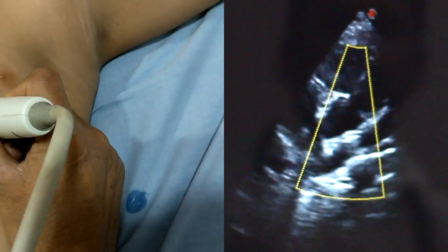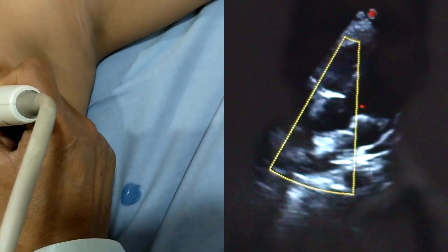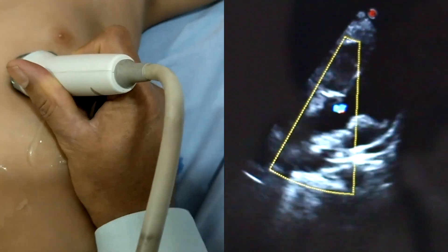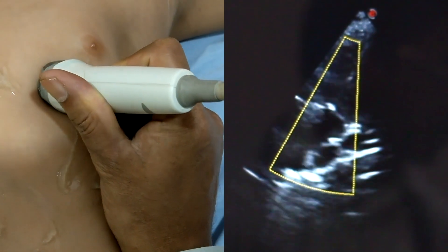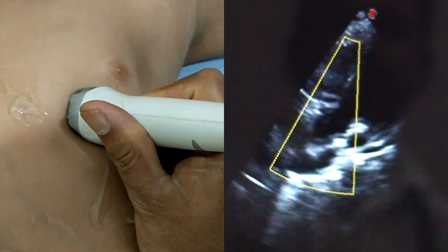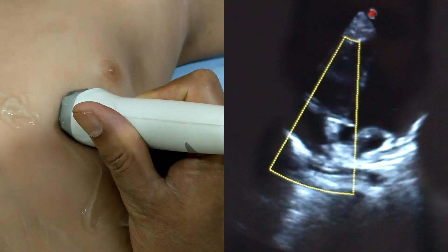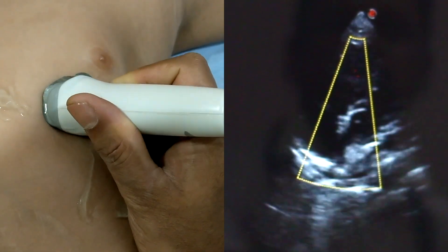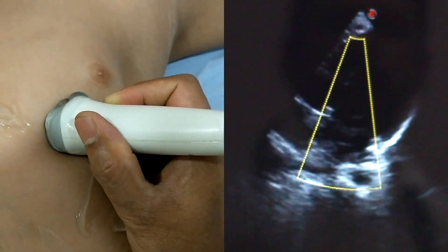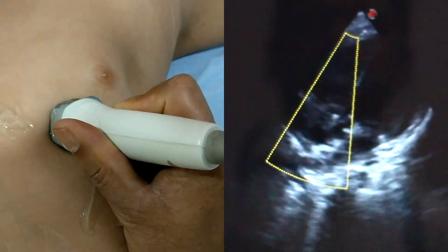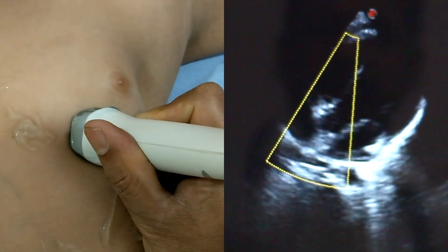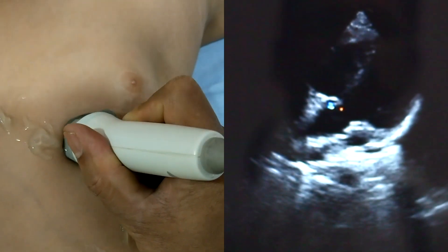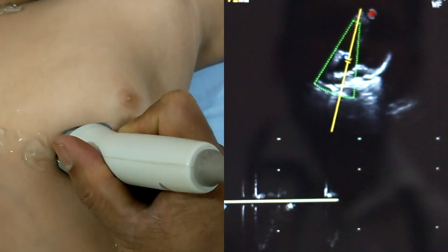This view is the apical five chambers view. Here we can clearly see the aortic valve and ventricular septum. Perimembranous VSD or muscular VSD — all types of ventricular septal defect — can be assessed from this view. By color flow, we can see whether there is any cross-flow between the septum and right ventricle.